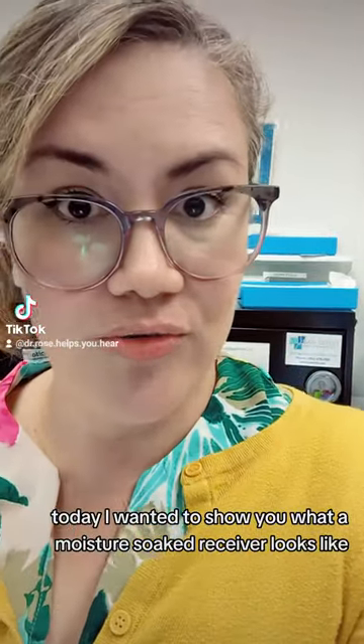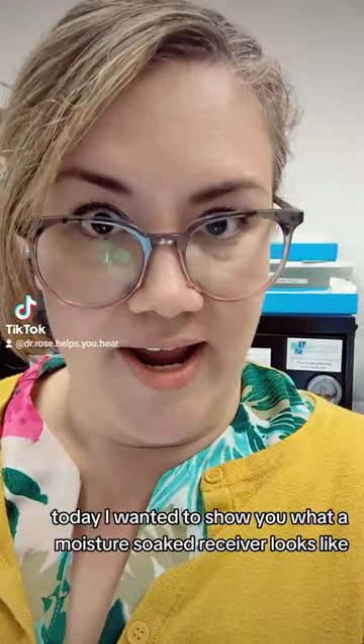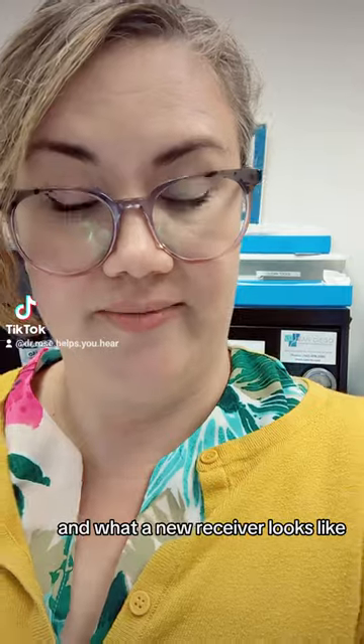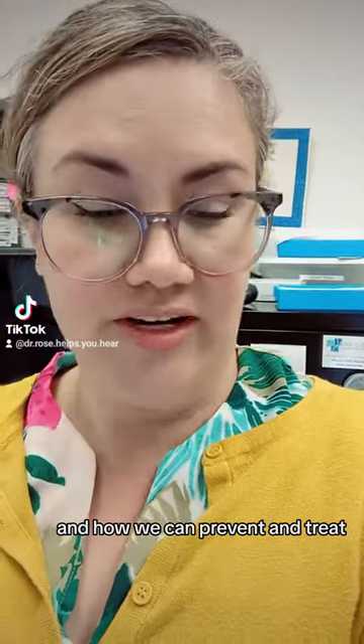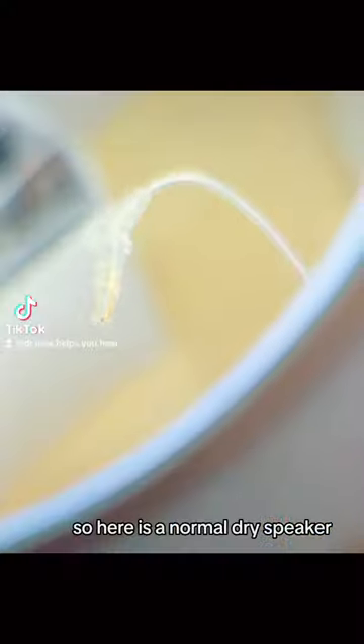Today, I wanted to show you what a moisture-soaked receiver looks like at the part where it goes into the hearing aid, and what a new receiver looks like, and how we can prevent and treat the moisture on the prong junction of your speaker.